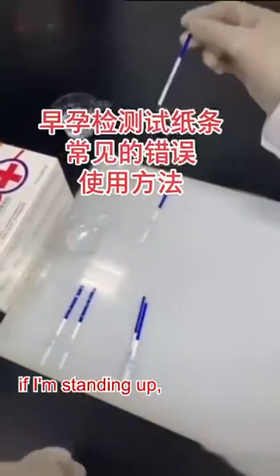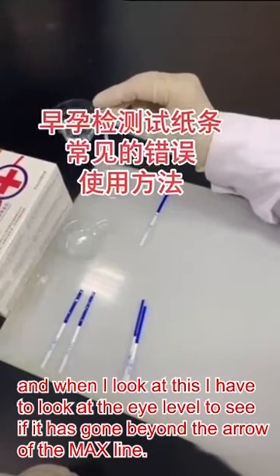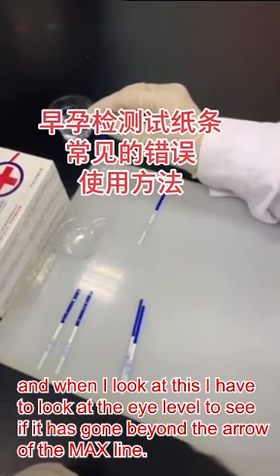If I'm standing up, I might not be looking at the most accurate position. When I look at this, I have to look at eye level to see if it has gone beyond the arrow of the max line.